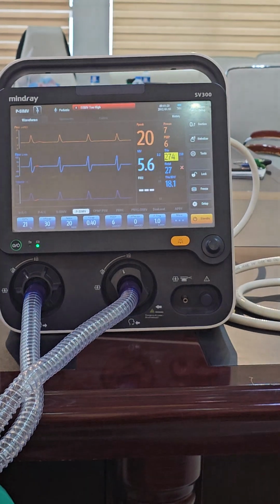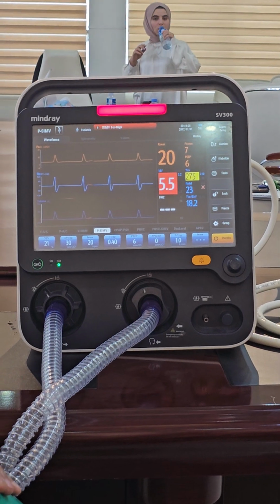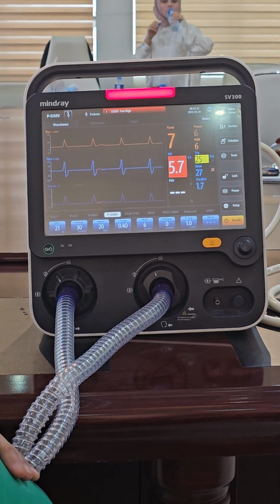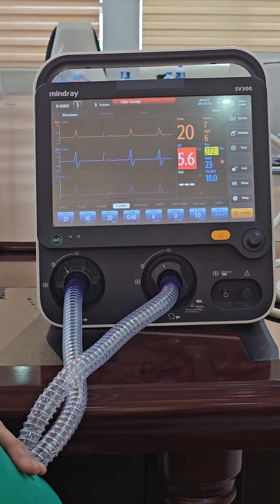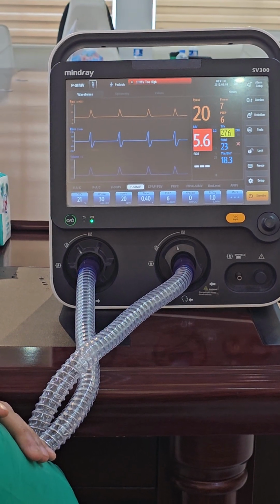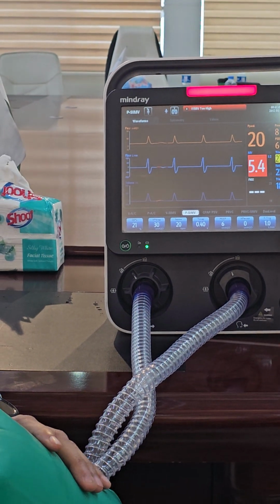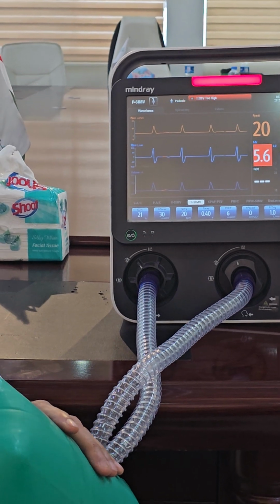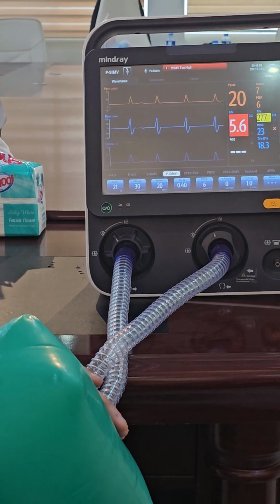In flow control, we tell the ventilator to measure the flow created by the patient in the previous cycle, and if it meets a criterion, give him the next one. Say we set it to 25%. When the patient achieves 25 or more of the previous, the next will be supported. If the patient achieves 30, it will be supported. If the patient achieves 20, it will not be supported. So the ventilator measures the flow of the previous breath and supports. But the baby will determine over how long he does it. There will be no set time.